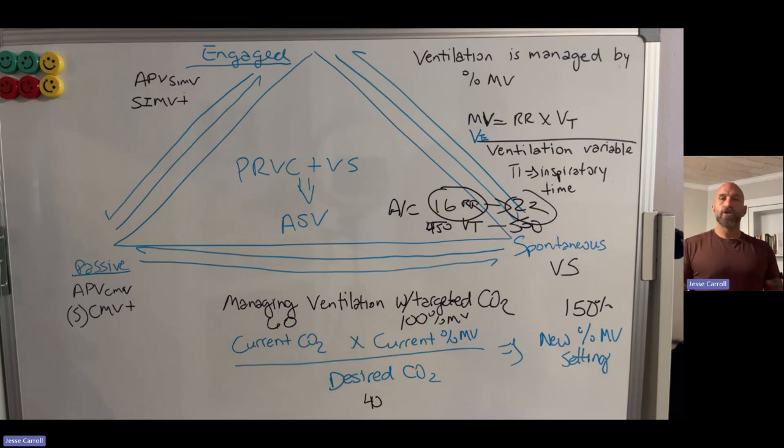They are sitting there triaging a mechanical ventilator from a conventional standpoint, something that they are not traditionally trained in. Hence why ASV and closed loop ventilation become extremely valuable in scenarios like this.